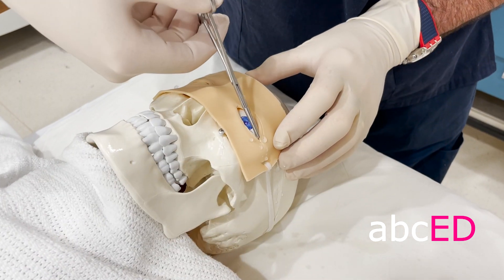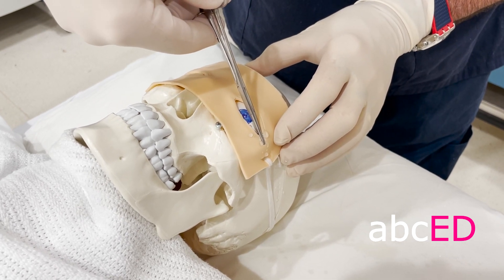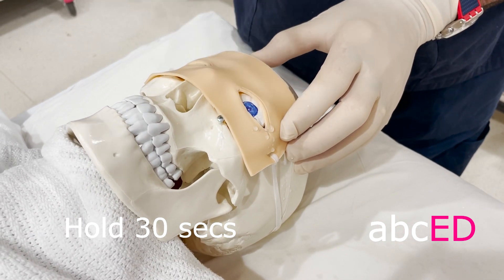Next we clamp the lateral canthus. This devascularizes it and makes the tissue thinner so it's easier to cut. We hold that for 30 seconds and release.